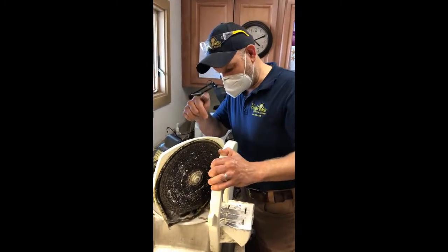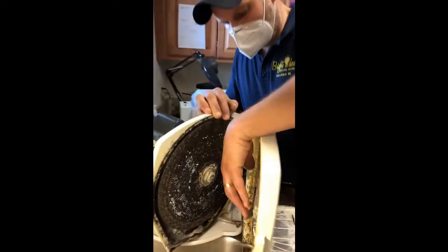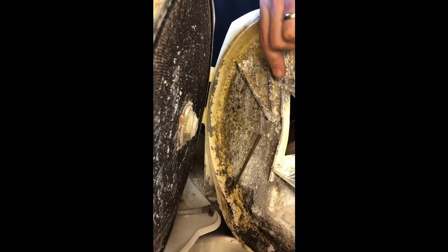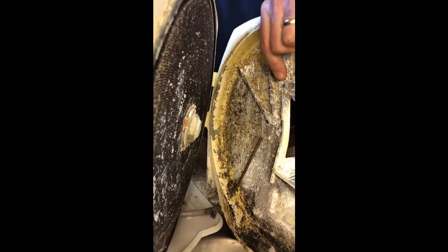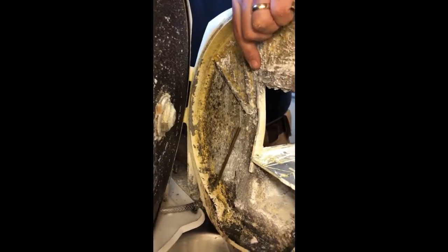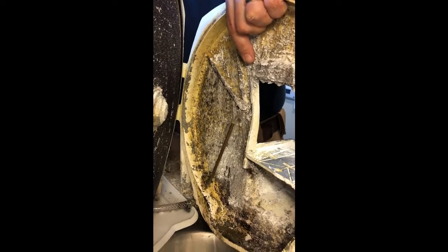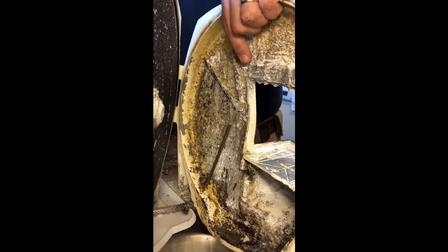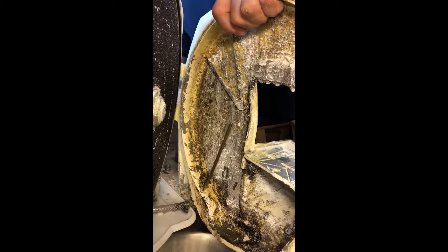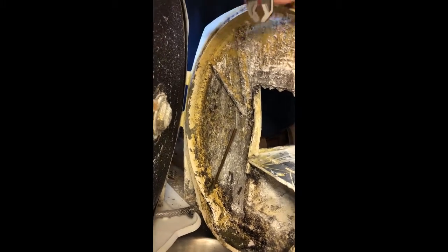Okay, so right now we have all the water hooked up. The tube right here is open still at the top, so if we open that up, water's going to come out of the top a little bit, and that's a way that we can flush everything out, all the debris. The last thing we're going to need to do is pinch off the top of the hose, which we're going to do with our pair of pliers here.